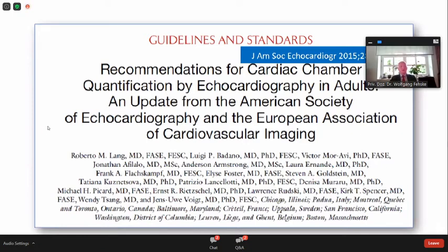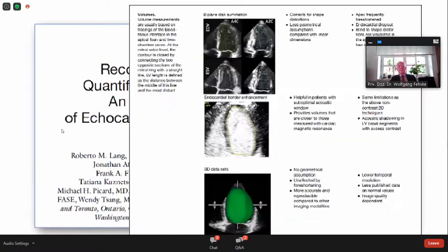summary of all publications which came out, and you all know that they explained to us that we should take biplane measurements for measuring ejection fraction. You can add contrast, and this is a company or industry interest, that contrast is not accepted worldwide everywhere, and they say this is, as correlated to MRI images, the better method, or you can even take 3D echocardiography.